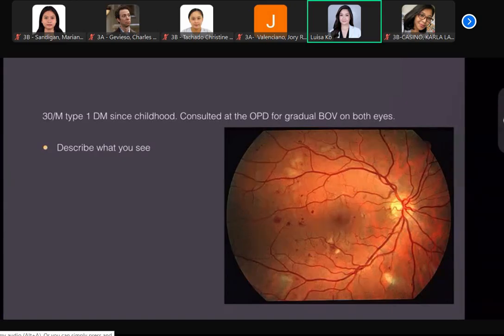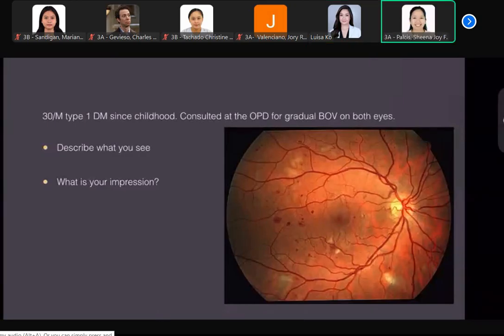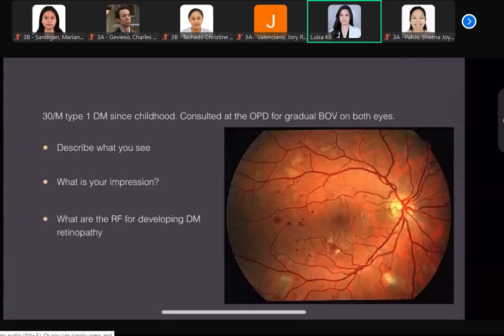There, you will see that the vessels are also more tortuous than normal, no? Sometimes this can be abnormal or sometimes it can be normal because some patients have more tortuous vessels, but ordinarily the vessel should follow almost a straight course, no? Like the normal fundus that I showed you earlier. So what's our impression here? Diabetic retinopathy, Doc. Good, diabetic retinopathy. I'm not going to torture you with asking what the grade is for diabetic retinopathy. It's a little difficult, no?